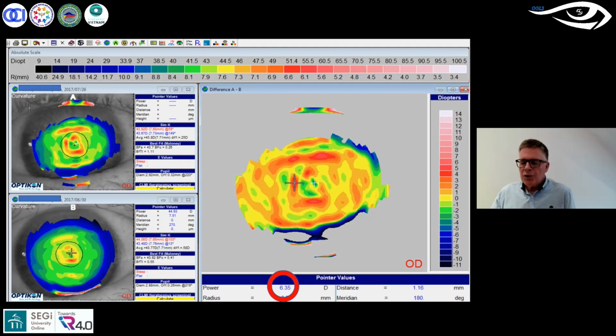And the question he asked was that in an age of technological excellence, should the keratometer not be consigned to the optical dark ages? Should we only use keratometers as a museum piece to remind us of a darker time? So that's where I'm going to finish, really.